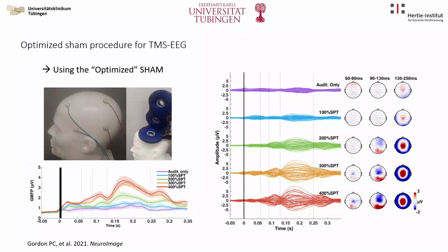And you can see here, using auditory input only, this is with the masking noise. So this is an example of relative success of using the masking noise. It pretty much made it a horizontal line, no response there. A few subjects could still hear. That's why you can see there in the P200, there's a tiny amplitude, probably because some subjects could still hear something beneath the masking noise, but overall very different from the evoked potentials from increasing amplitude of the sensory stimulus.